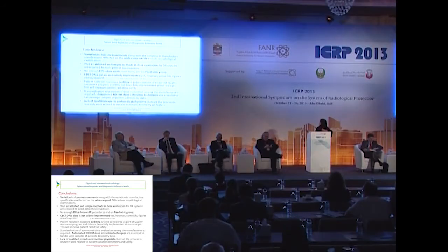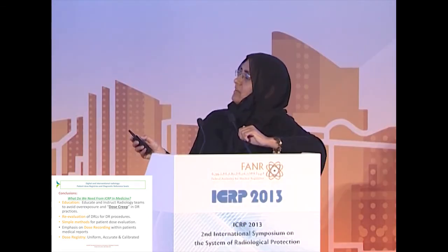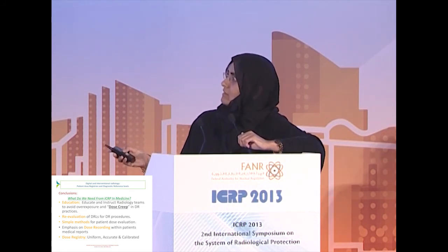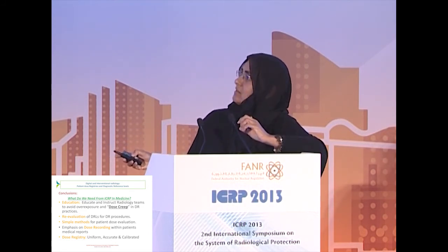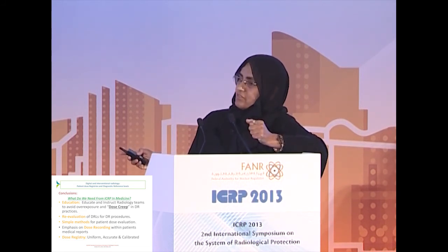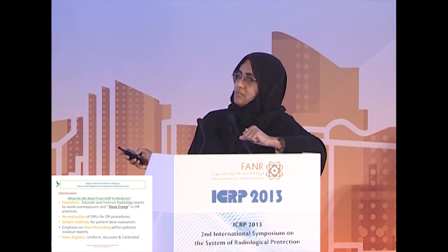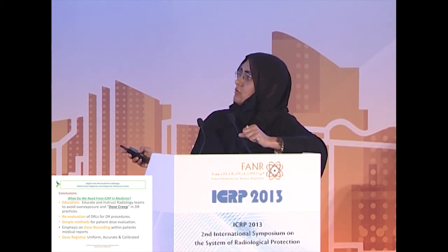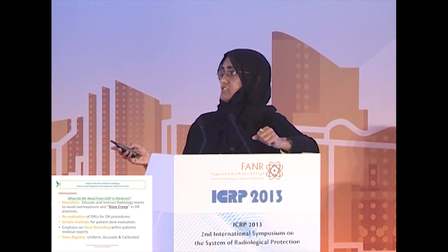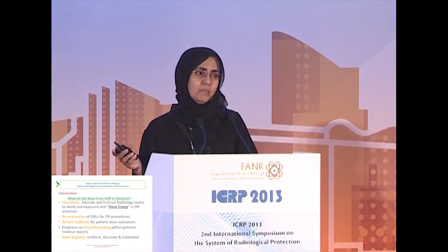Okay, since the theme of this session is what do we need from ICRP in medicine, I highlighted here some points, and I'd like to have a discussion on this. Education is very important and it's needed. Re-evaluation of DRLs, as mentioned in ICRP 93. Simple methods, dose recording, and dose registry. It's more important to be uniform, accurate, and well calibrated.